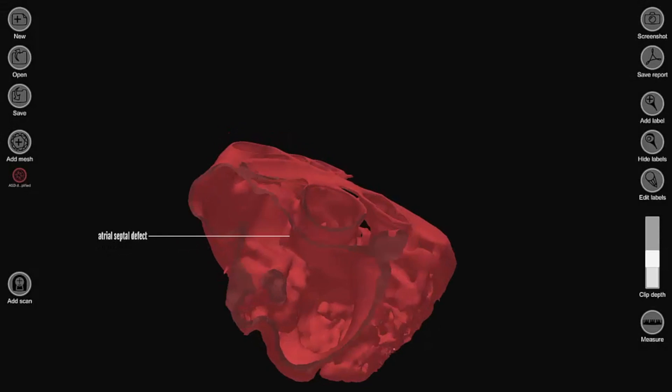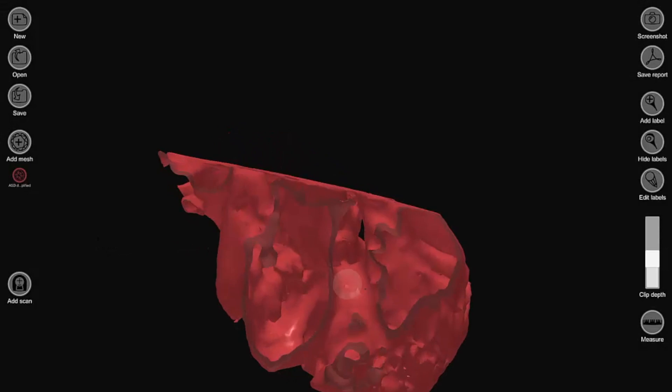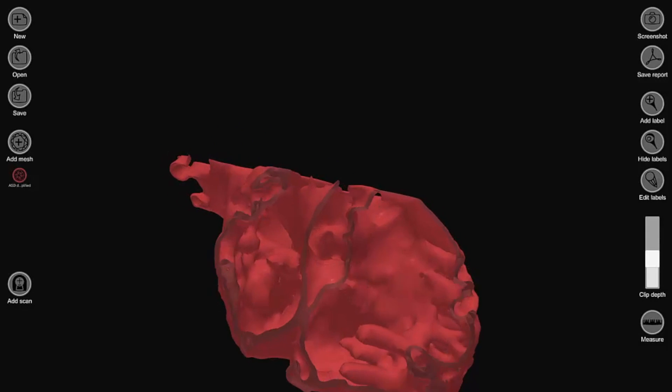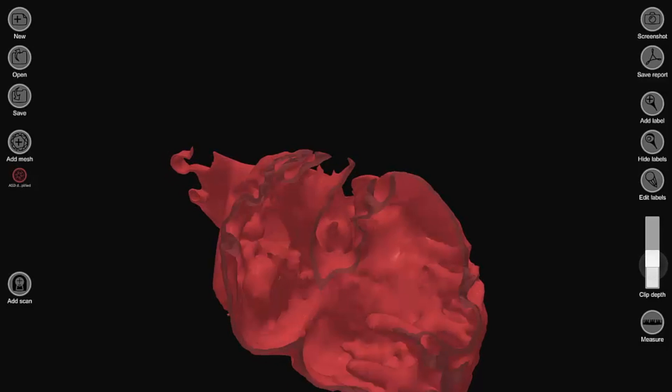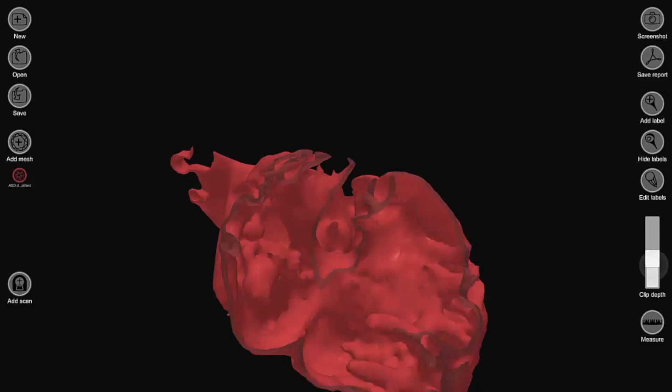We can add labels to any important parts of the 3D model, and the labels will stay put no matter the vantage point.